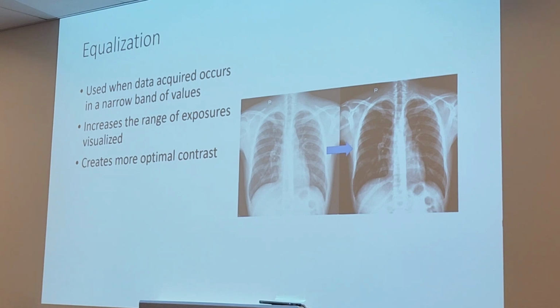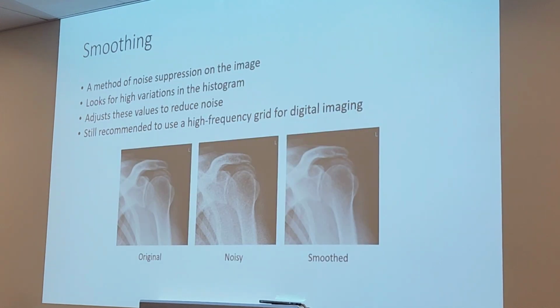Almost like how we did it with automatic rescale. So if your automatic rescaling doesn't work out, you can always try to equalize your image. Your console may or may not have options to do so.